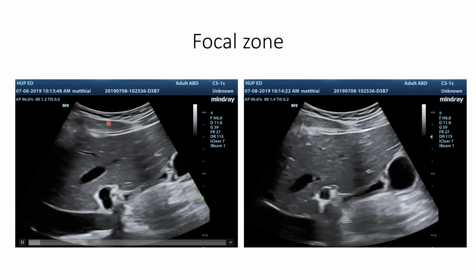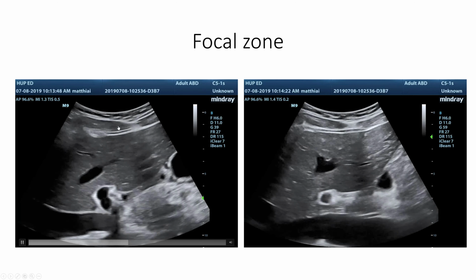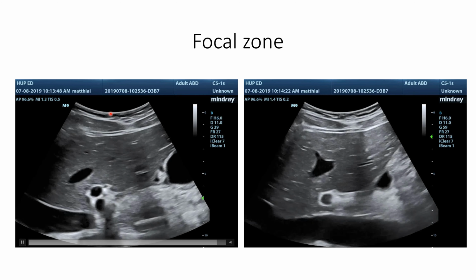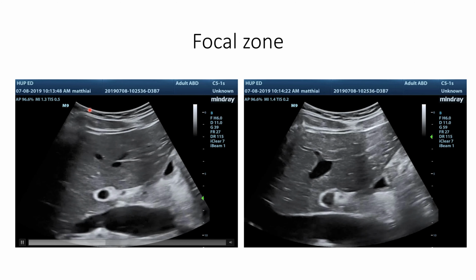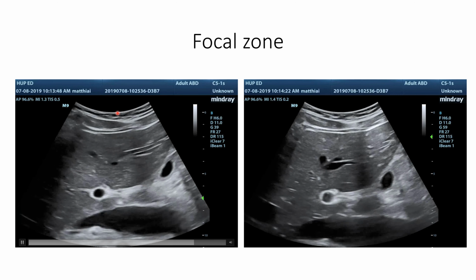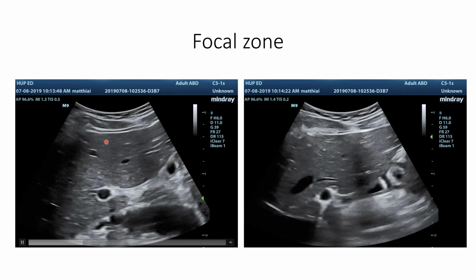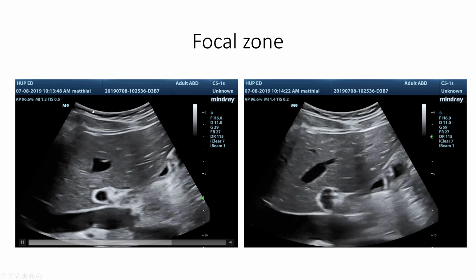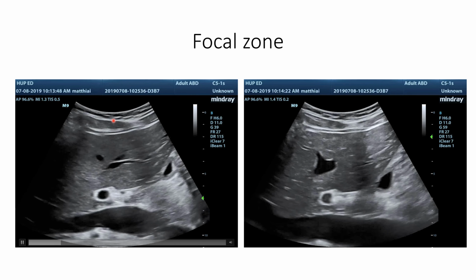When you're sending out a beam of sound from the ultrasound to come down and view this portal vein here, it's really not just a laser-like beam of sound coming from one transducer element. All of the beams of sound get created by a lot of transducer elements. It tends to be about half of the total transducer elements in the probe, centered on the element that's making the sound beam that's displayed on the screen. And they make a sound beam by converging on the midline of the sound beam that's shooting down.